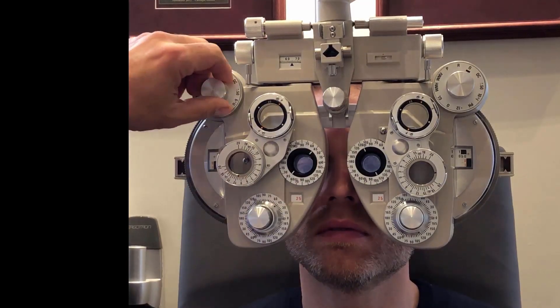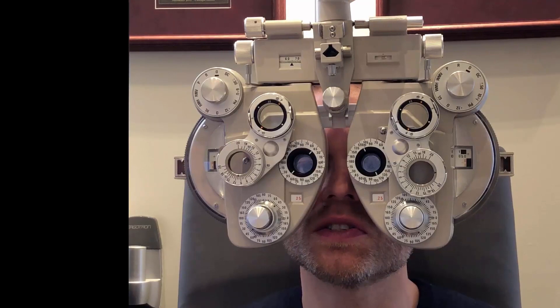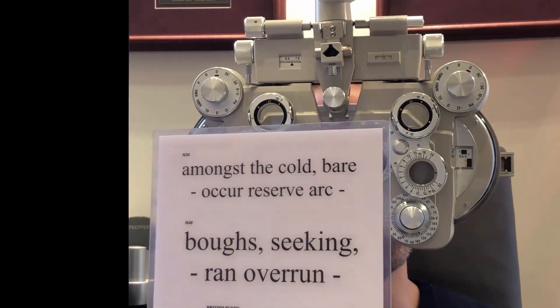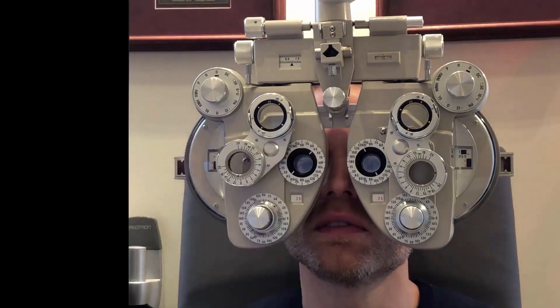How far down can you see there? H-C-D-R-O. Great. And how far up can you read here? Printing of this size is used only for special languages. That's very easy.